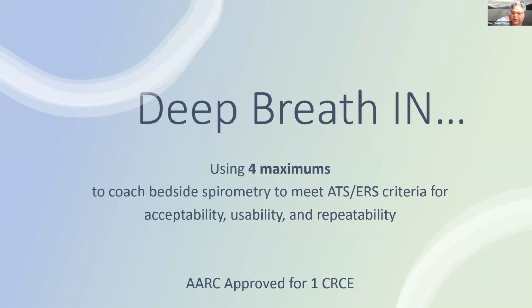Take a deep breath in. Spirometry is the most common pulmonary function test, and it is widely used in the assessment of lung function to provide objective information used in the diagnosis of lung diseases and monitoring of lung health. Today, we are going to use 4 maximums to coach bedside spirometry to meet ATS ERS criteria for acceptability, usability, and repeatability. And this is approved for 1 CRCE with the AARC.